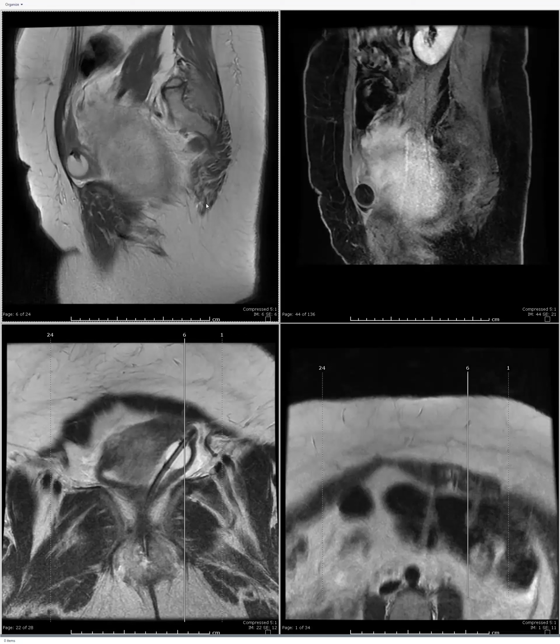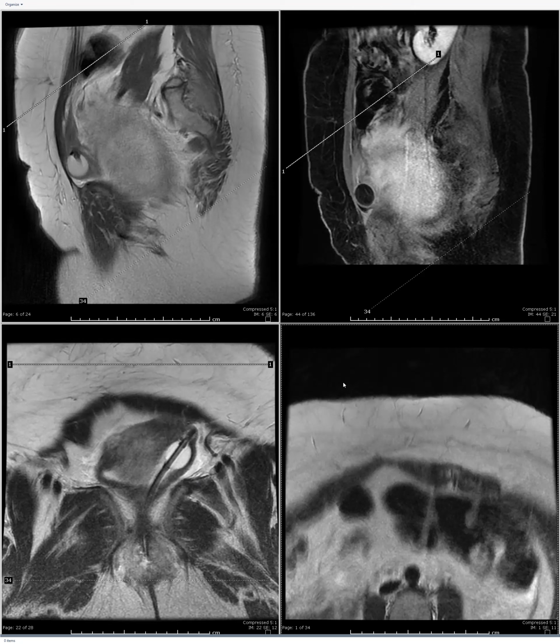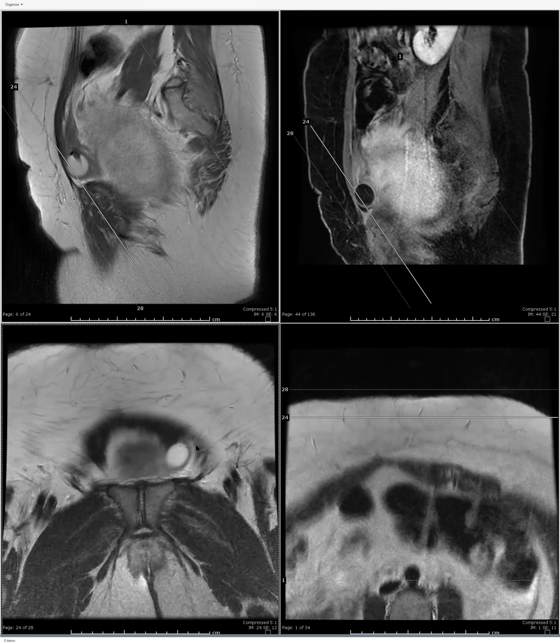Okay, Omar. Okay, so this is a postpartum female presented with uncontrollable vaginal bleeding following a very complicated vaginal delivery. They initially took her to IR and she got uterine artery embolization that stabilized her bleeding. And then OB surgically explored her and they saw a uterine mass. And they got this pelvic MR to further characterize this mass. And so what we see.